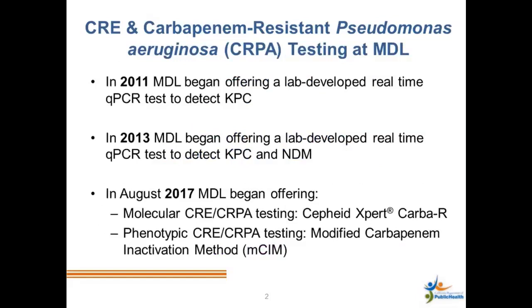In 2011, MDL began offering a lab-developed, real-time qPCR test to detect the carbapenemase gene KPC. KPC is the most common carbapenemase reported in the United States. In 2013, that test was replaced with a lab-developed real-time qPCR test to detect KPC and the additional carbapenemase gene NDM.